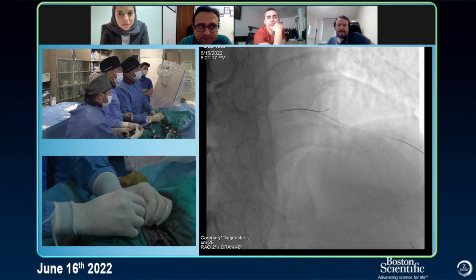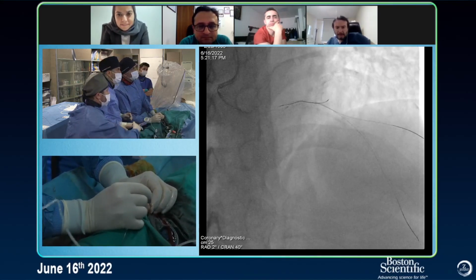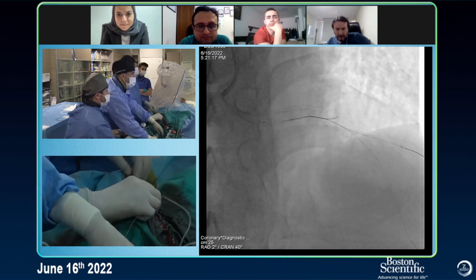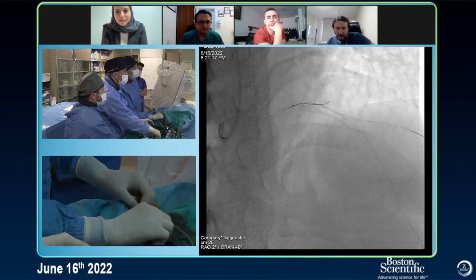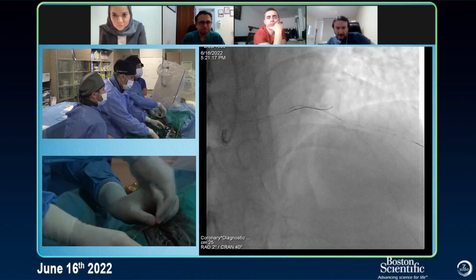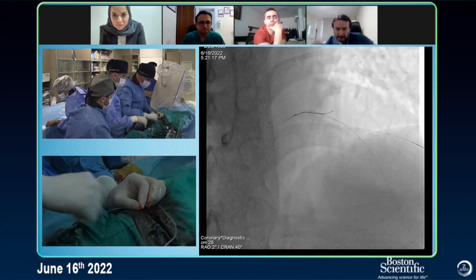Yes, also interference with it. All right, it's coming. If I insert this, which is not easy, this is a big balloon. I'd like to anchor it. I'm afraid that I lose the stent because of the proximal part. It happened to me some time ago.